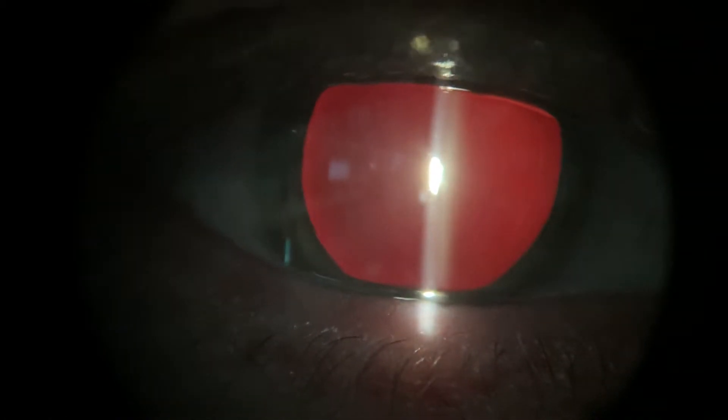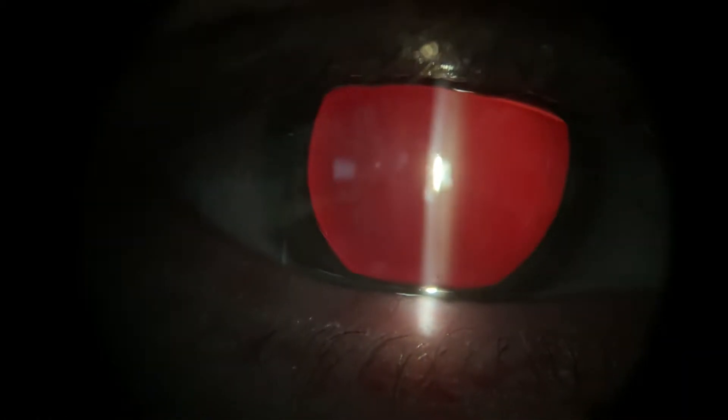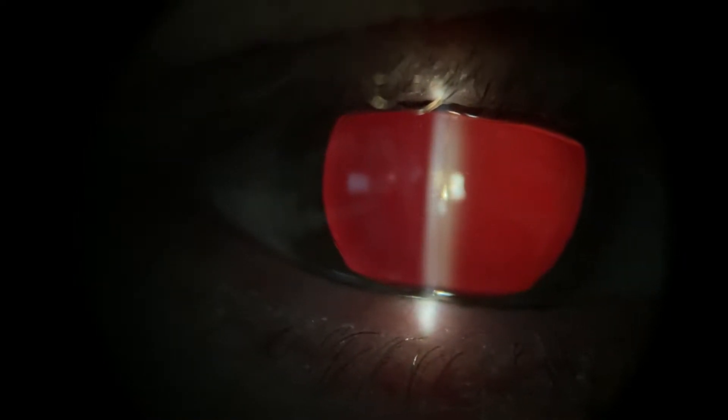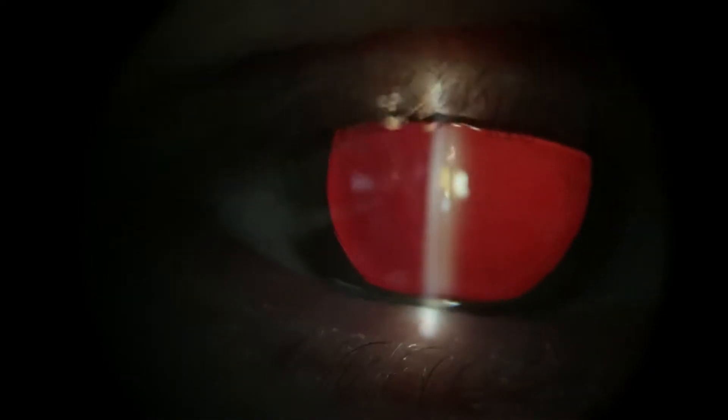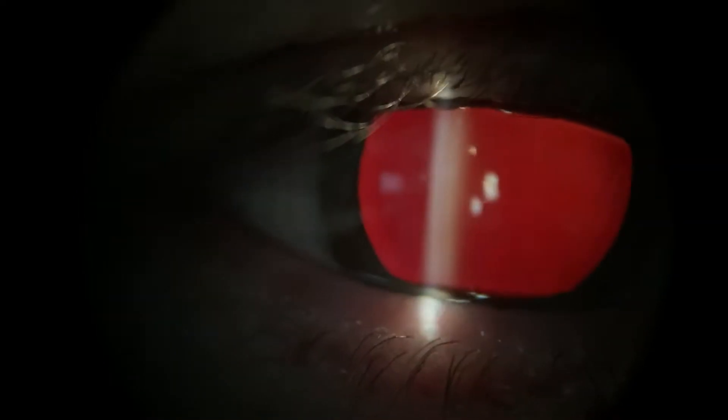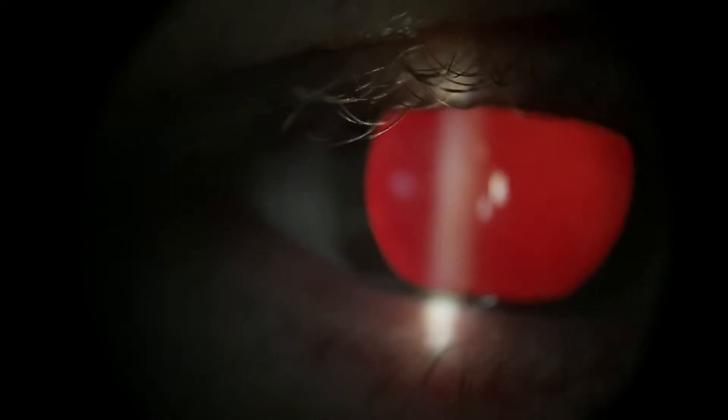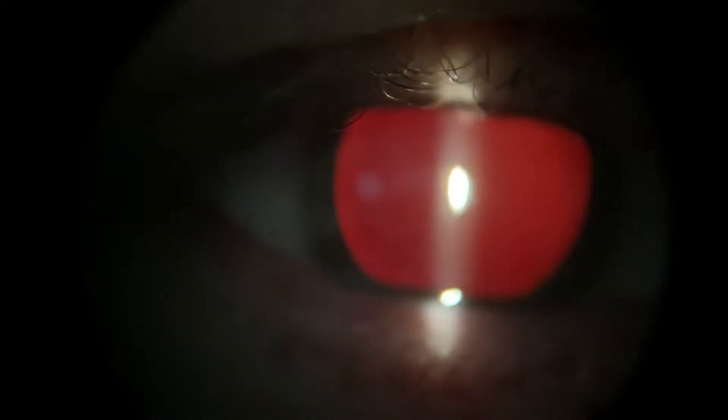Today I'm with a very pleasant 62-year-old gentleman who works as an HGV driver and we're going to examine his eyes and talk through the case and see if there's any interesting signs or symptoms that you might notice.